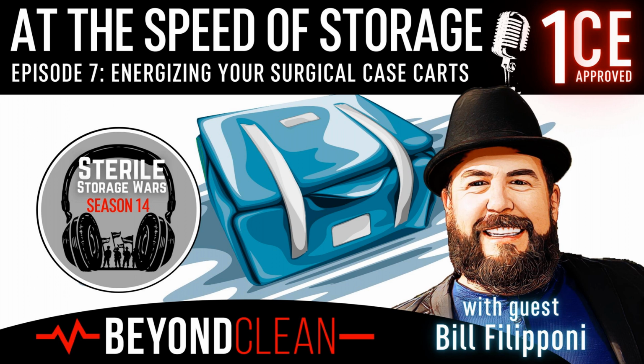So it was a little bit better, where we had water and soap and detergent and steam that we could actually use to spray. Like a car wash. It's almost like a big cart wash. Yeah, with two valves on it, one for water, one for steam. Obviously it was dangerous, right? Because you're using a hot steam gun inside of a room, so if you touch it on your arm or something, it's going to melt right through a gown and burn you.